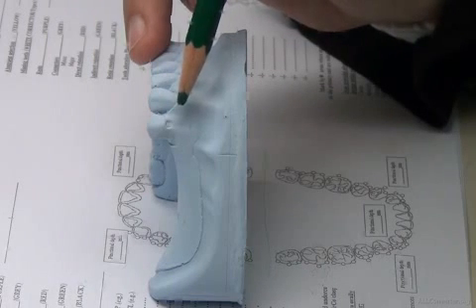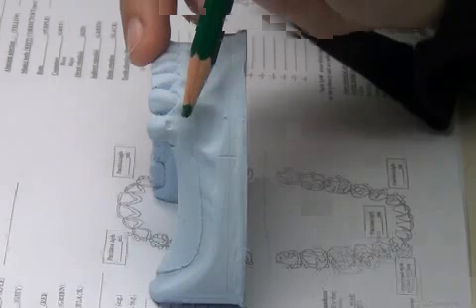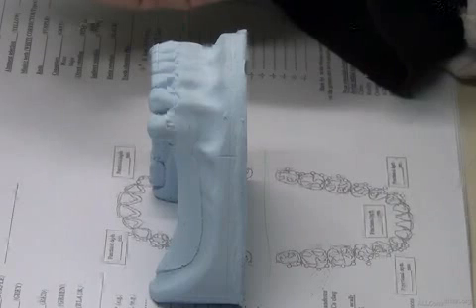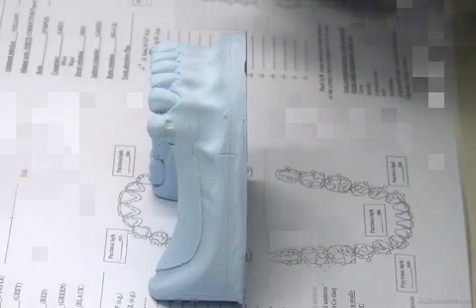Circumferential clasp, 1 millimeter at least, whereas with gingivally approaching clasps, all of them at least 3 millimeters. Right? Okay, proximally, mesially or distally, it depends on the clasp once more. Where am I going to put my clasp? If it's an I-bar, I prefer it to be in the mid-facial, slightly mesial. This is the area of option. What will happen if I have it close to the saddle area? Distal undercut, I begin to think.